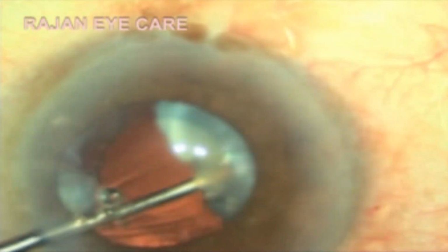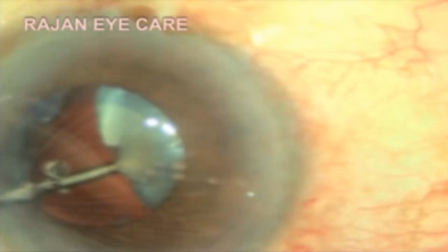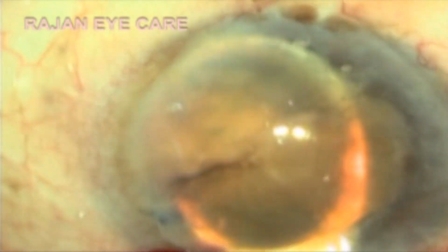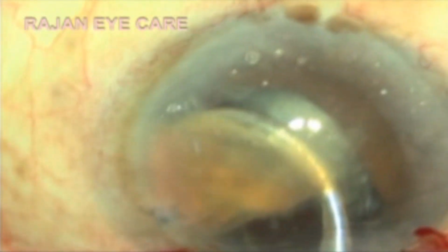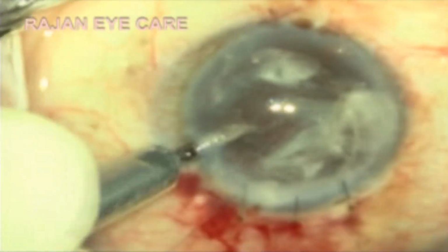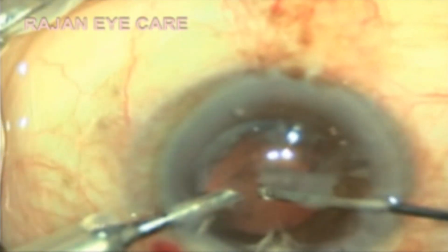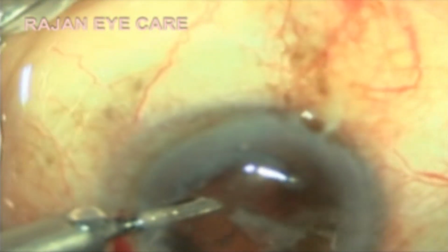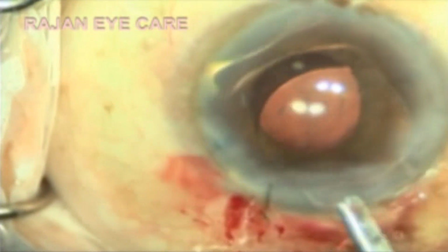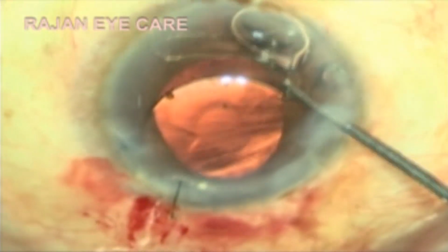This case shows an anterior assisted levitation of a dropped nucleus wherein the nucleus is brought into the anterior chamber and delivered through an enlarged limbal incision. Preservative-free triamcinolone is used to delineate the vitreous and a bimanual anterior vitrectomy is done to clear the anterior chamber of the vitreous, followed by an anterior chamber intraocular lens implant.